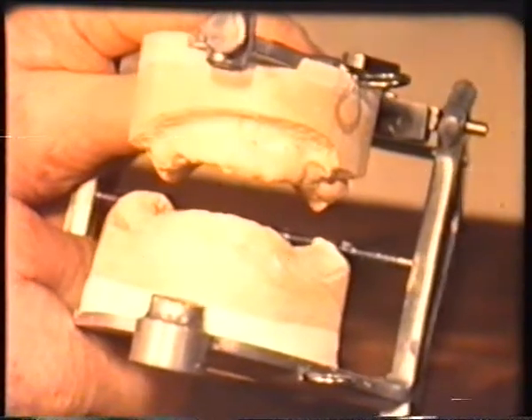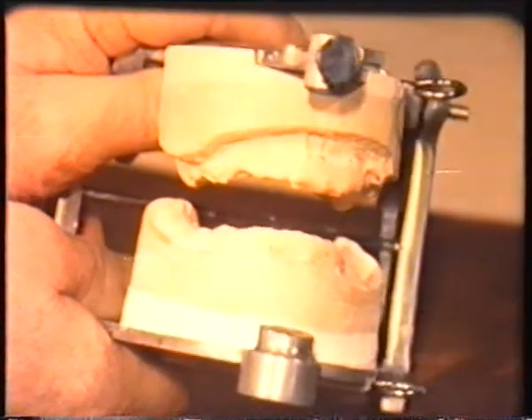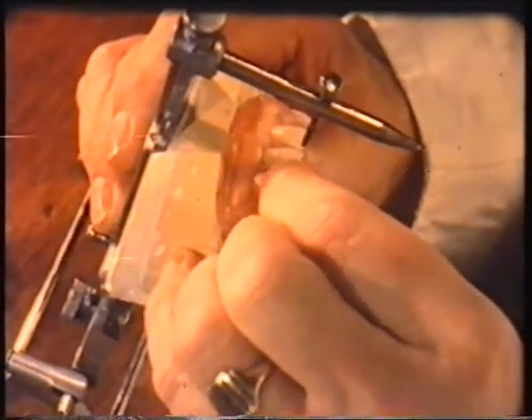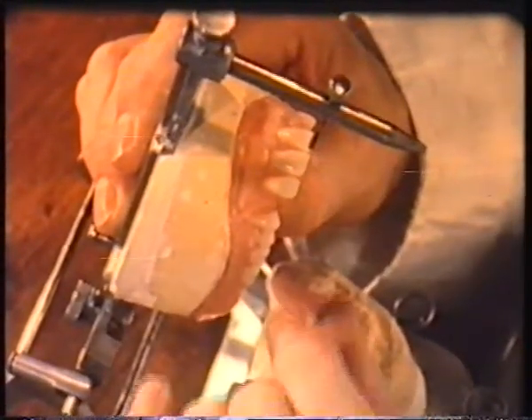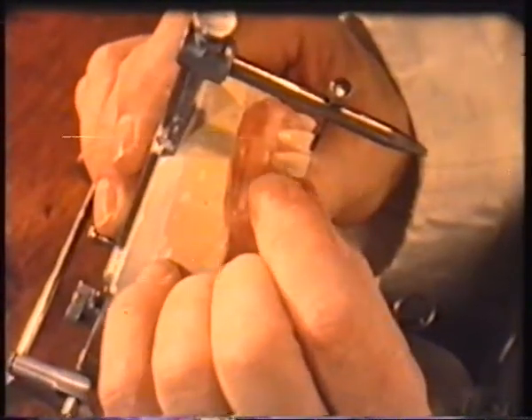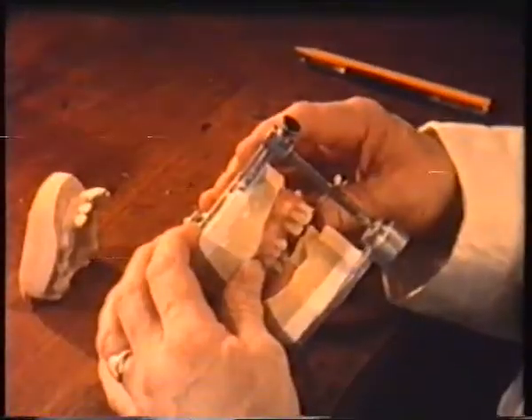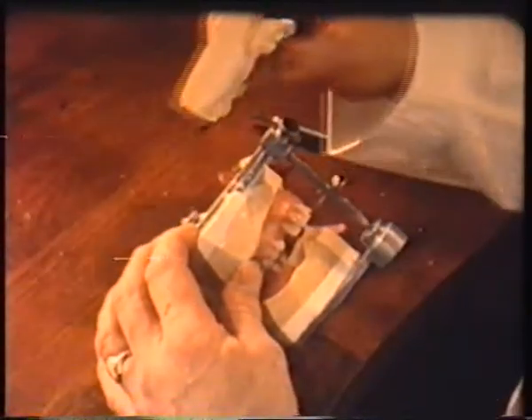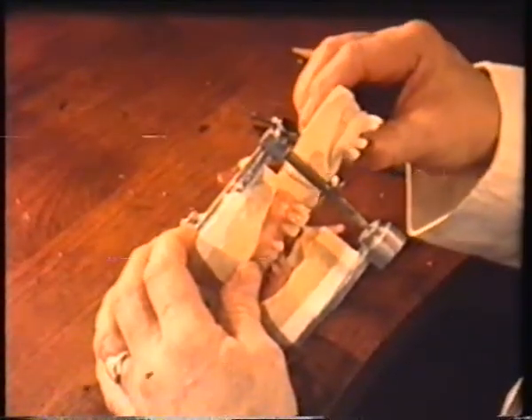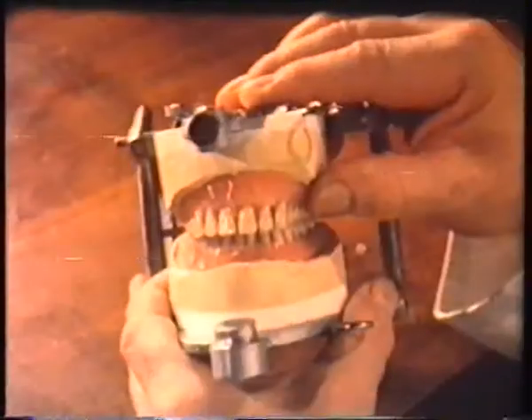When this modification of both the models has been completed, the technician can continue his work by setting the anterior teeth. To assist him in this task, a duplicate model of the existing condition is helpful. In this case, the position of the anterior teeth has been modified slightly to improve appearance.